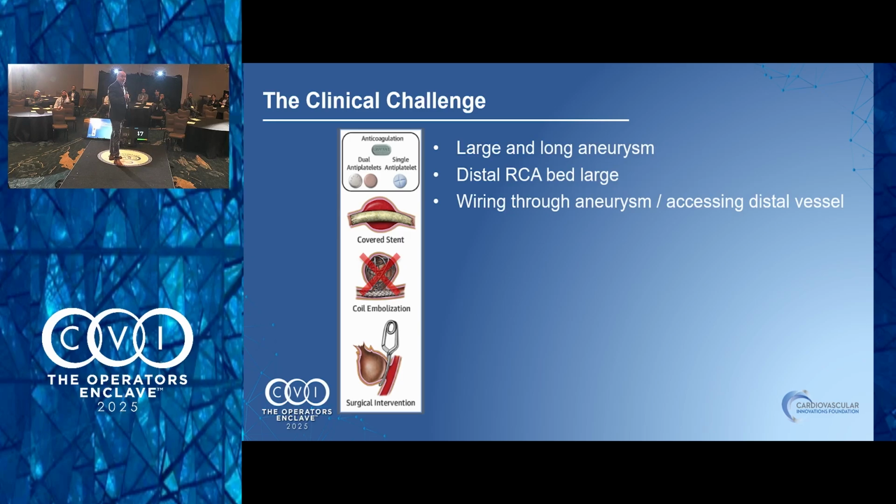Because it looks like it just empties into that pseudoaneurysm? Keep on going with your thought process. Well, what I'm saying is, you don't need the right coronary artery if it's going nowhere. Okay, so you just coil it totally. Just coil it, yep, it took me a second. Sorry, Paul. Because of the CT scan, it was a late night, I know. I crashed.